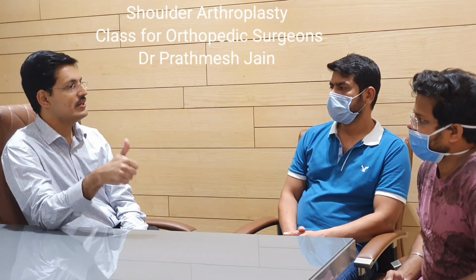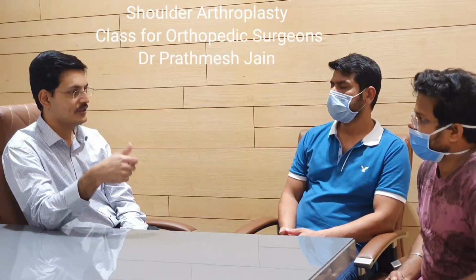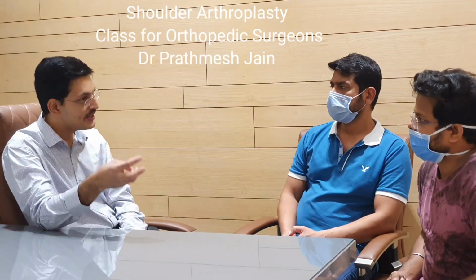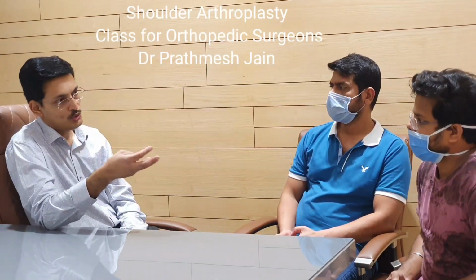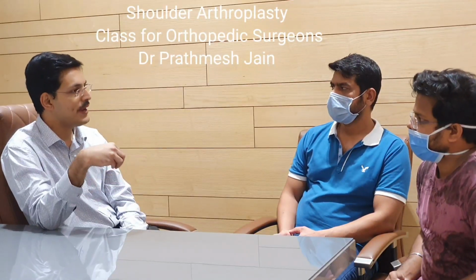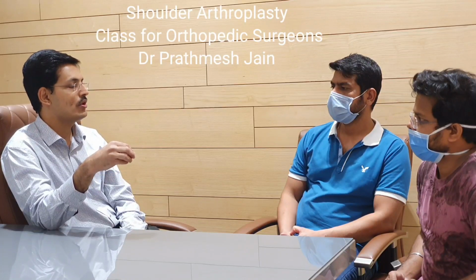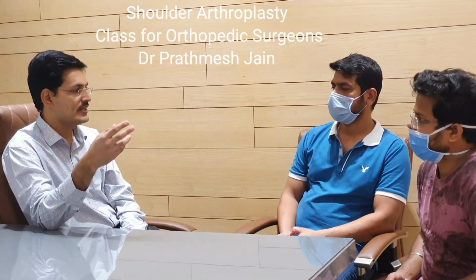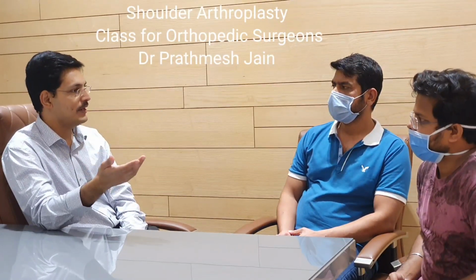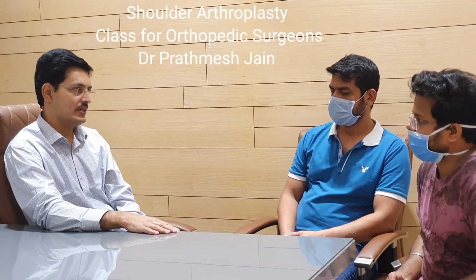First indication for a reverse shoulder arthroplasty is a rotator cuff tear arthropathy. Then you can do it in osteoarthritis, rheumatoid arthritis, post-traumatic arthritis, as I told you, tumor cases and trauma cases, and lastly in all bad cases, all neglected shoulder cases, or all failed shoulder cases. If you have had some shoulder surgery done and it is not successful, then we can plan and do these kinds of reverse shoulder arthroplasty cases.